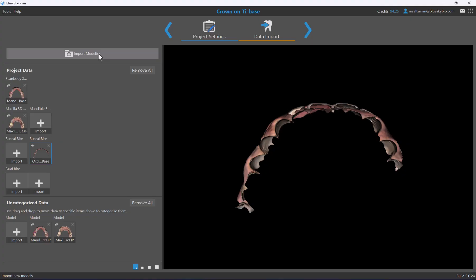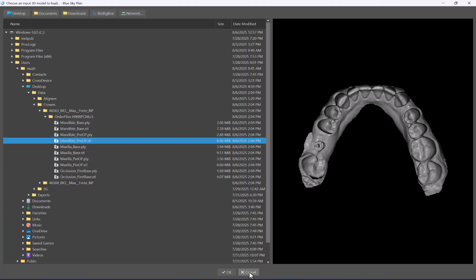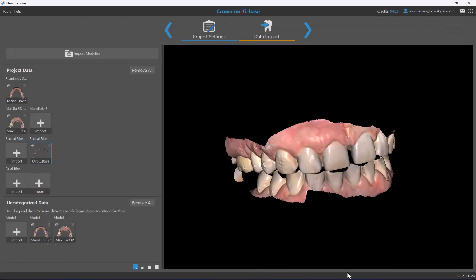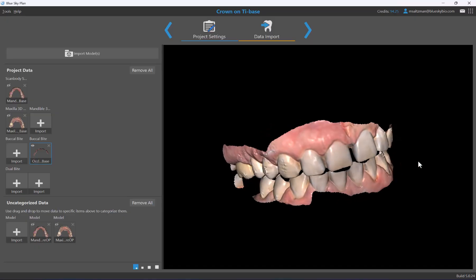If you want to import a particular model, click the plus for that category, select the relevant model and import it. You can also import all models at once using the import models button for multi-selection. To load this case, click next and it will get the case started. If you have any questions regarding the new introductory screens or Blue Sky Plan, email us at plan@blueskybio.com.